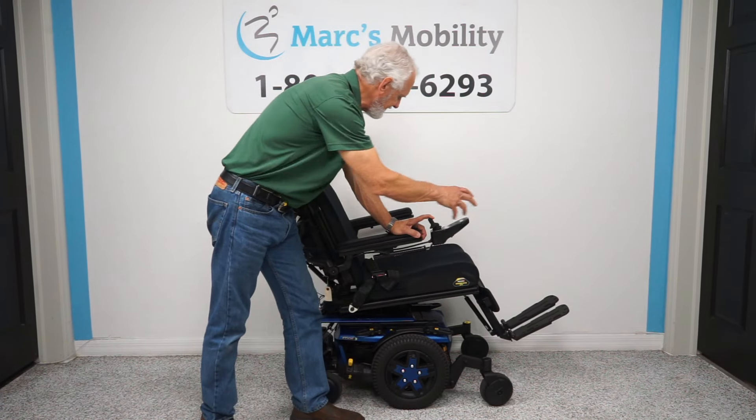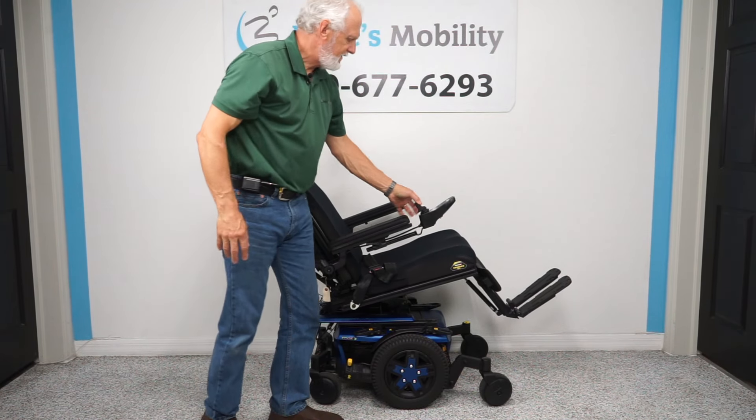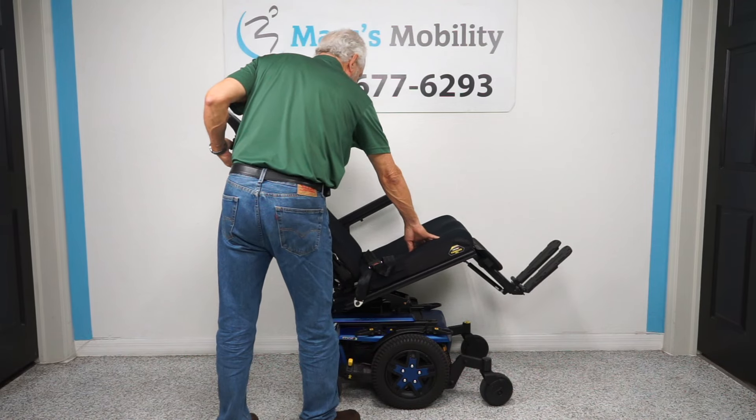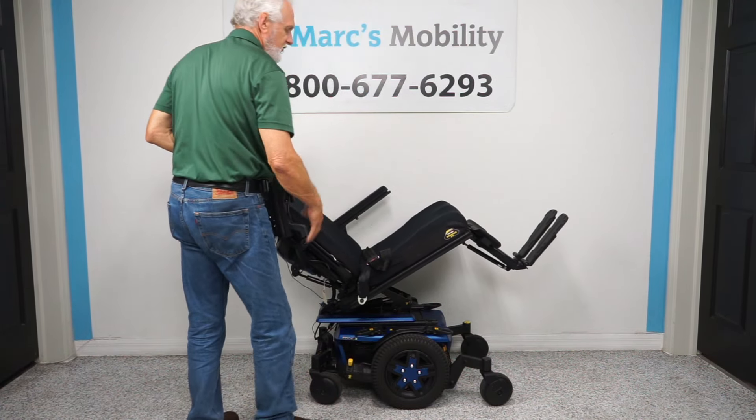That means the bottom is going back, so the legs and the back are going to go back because they're all attached together. This is really good if you need circulation, want to take pressure off your bottom or your back, or you just want to relax.